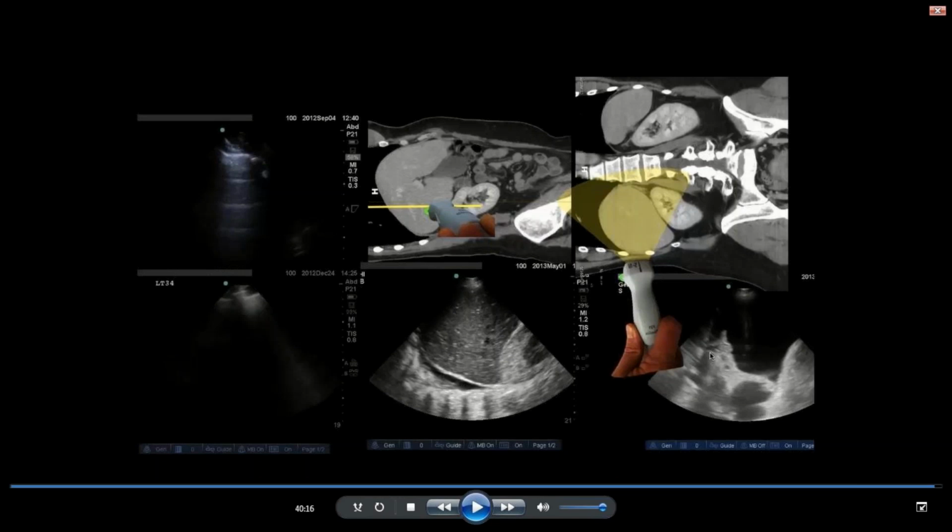Remember what I highlighted when I was discussing the section on consolidation: if you are trying to pick up a small area of consolidation that's rather posterior and deep to a surrounding normal lung tissue, there's a good chance you'll miss it anyway. I do tend to start deeper when I'm suspecting consolidation compared to when I'm doing a pleural assessment. I prefer to start out with more superficial settings using a high frequency probe, and moving on to a lower frequency probe for consolidation.